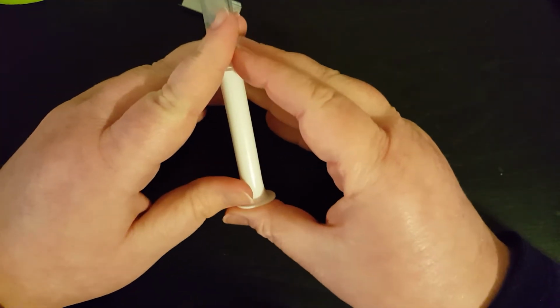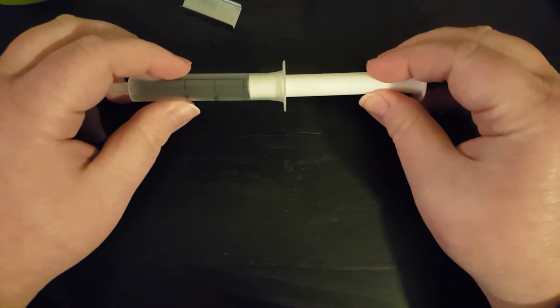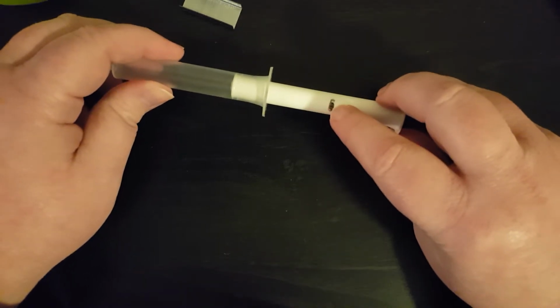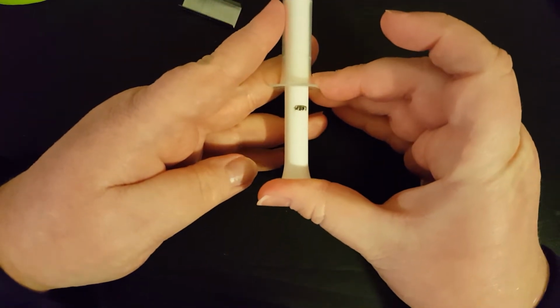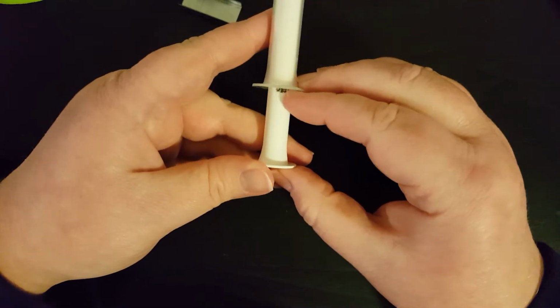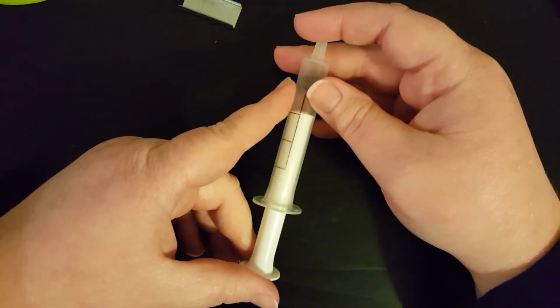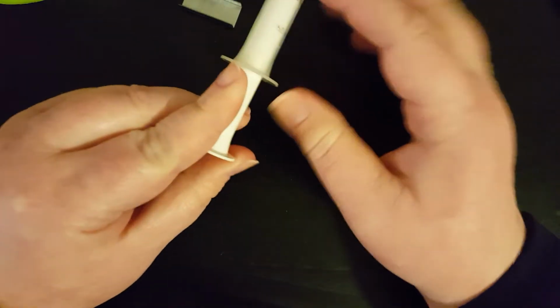To make this easier, because for someone who can't see, it's really difficult to mark this, a low vision user might mark a point on their plunger where they have to meet the end of the barrel, like so. It's just a black mark that they could see, and they could even put a label on here, maybe 2.5 milliliters. This syringe has 2.5, 3.75, and 5 milliliter increments, okay?